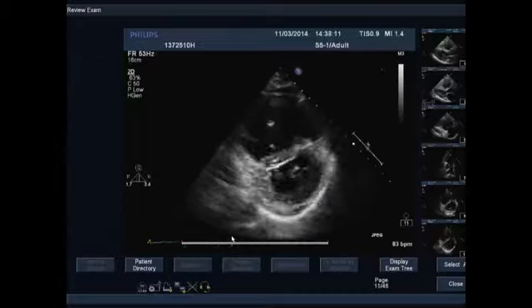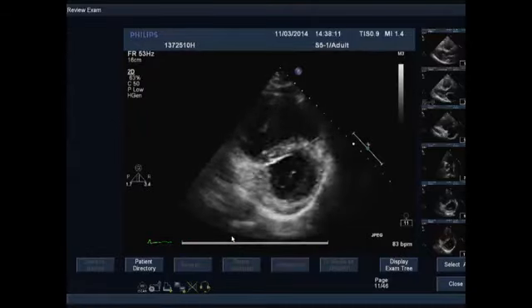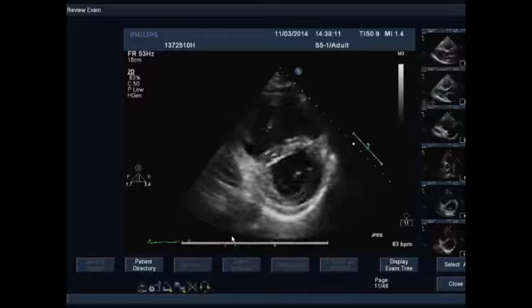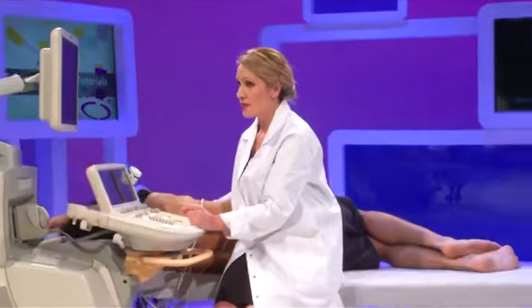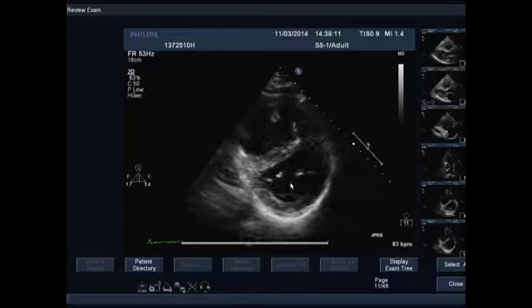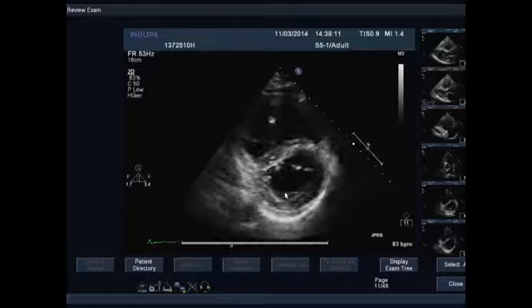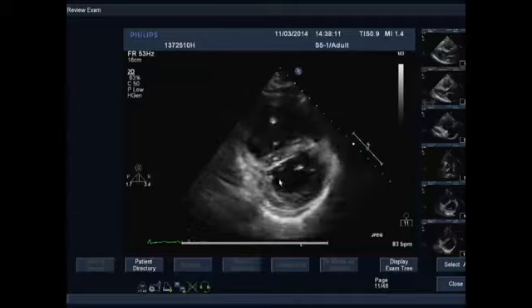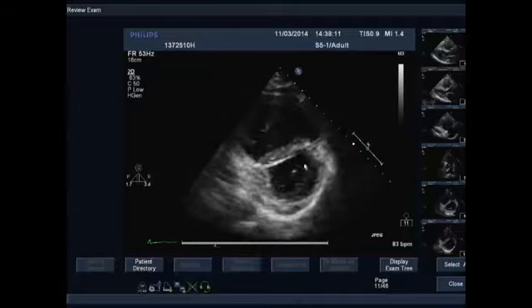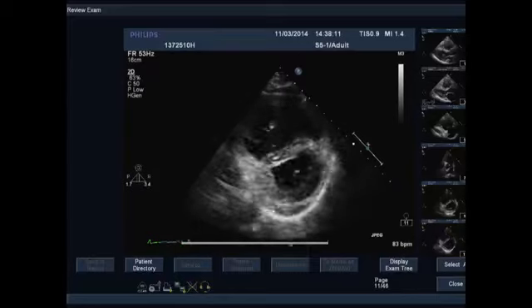And this is the first view to start our parasternal short axis assessment of the left ventricle together with the right ventricle. So from the parasternal short axis view of the mitral valve, initially we judge if the mitral valve is structurally abnormal, and in fact here we are able to see the anterior and the posterior leaflets, and that is a structurally normal valve. But the most important thing is to assess the shape of the left ventricle, and further, to assess whether it's pressure or volume overload.